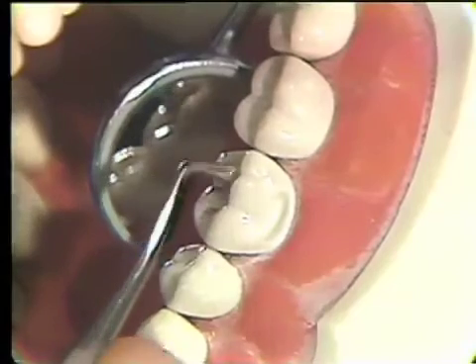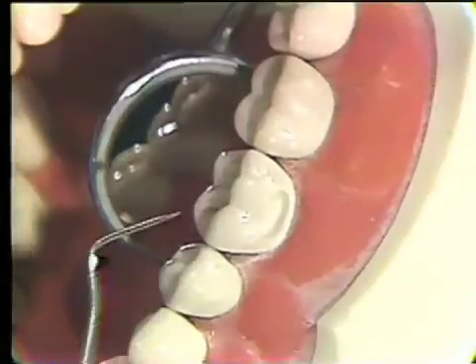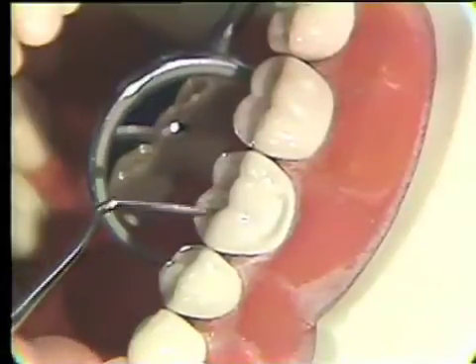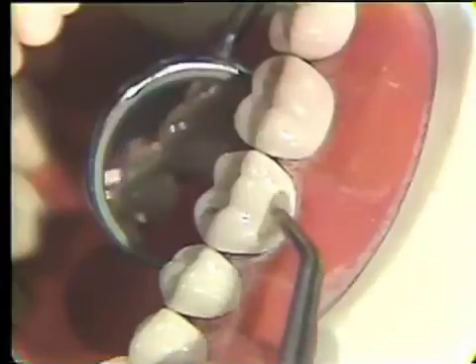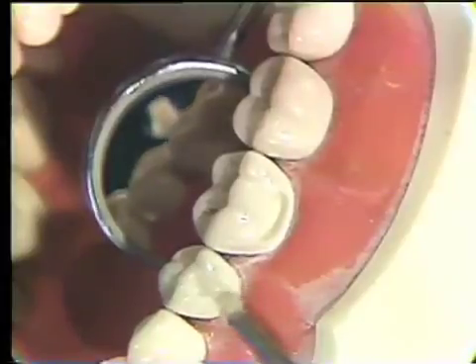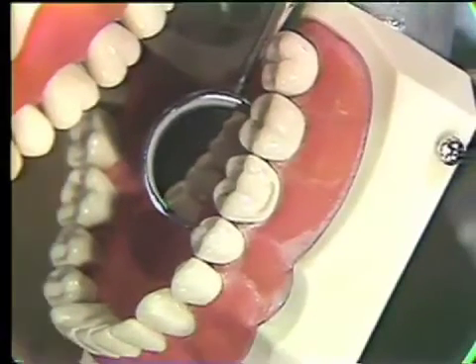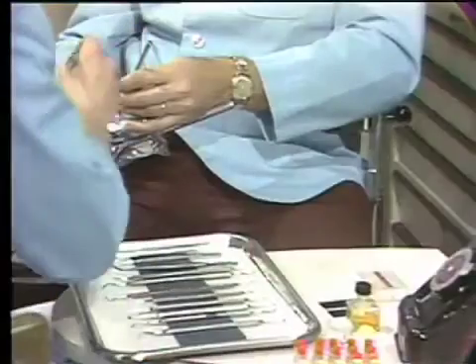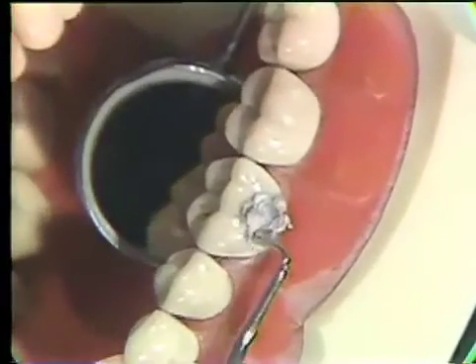Before we insert our class five, let me review a couple of things on this class one. After carving, we could have taken a burnisher and gone back and re-burnished our surfaces, which would have smoothed them up quite a bit. One thing I don't want you to do — and you may have noted I didn't do — is put in sharp anatomy. Sometimes students like to place very sharp anatomy in occlusal restorations, but much of this anatomy becomes food retention and collection areas. A small rounded area at the base of the anatomy is very adequate. Notice we've placed the Copalite again, blown it out gently, and now we're ready for the packing of our amalgam for the class five. Here we're going to use the right-angle plugger, which is just easier to get access into these class five areas.